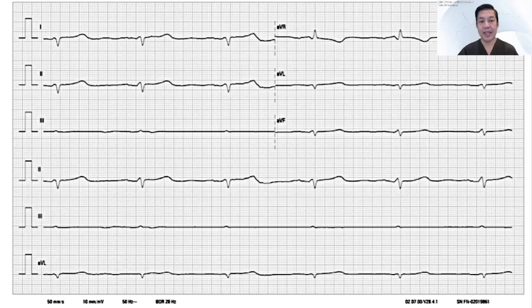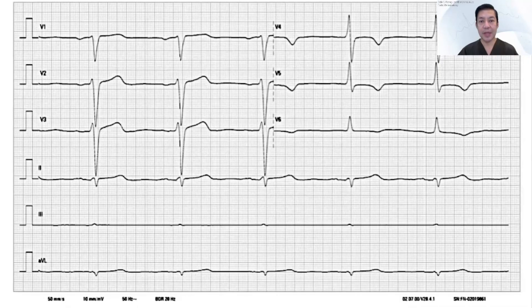This is the ECG tracing showing the limb leads: lead 1, lead 2, lead 3, AVR, AVL, and AVF. Precordial leads: V1, V2, V3, V4, V5, and V6.